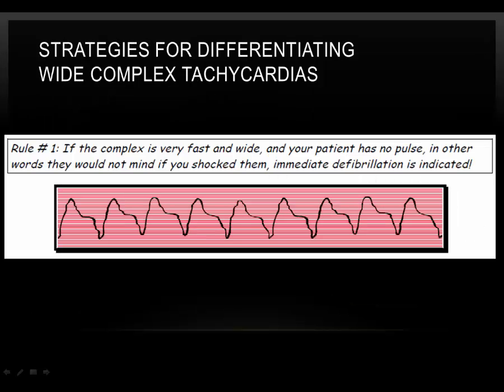The 2000 guidelines of the American Heart Association put an end to unknown origin wide complex tachycardia by calling for a 12-lead ECG to attempt to diagnose the specific rhythm. In other words, they strongly discourage a give-a-drug-and-see-what-happens approach. The 12-lead ECG is 96% diagnostic for VT identification. There have been several criteria used.